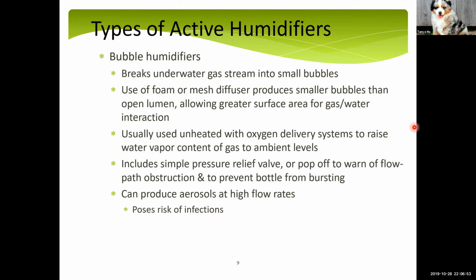So essentially anything over 6 liters per minute, which by the way, you're not supposed to use a nasal cannula greater than 6, but at higher flows, you'll see the humidifier can't really handle it. And it can, in fact, produce an aerosol because the bubbles are just blowing so fast. And if that happens, it's basically not appropriate. And once you do produce an aerosol, there is a risk of infection. So water vapor does not carry pathogens, but aerosols do. Okay, so there's higher risk of infection with aerosols.